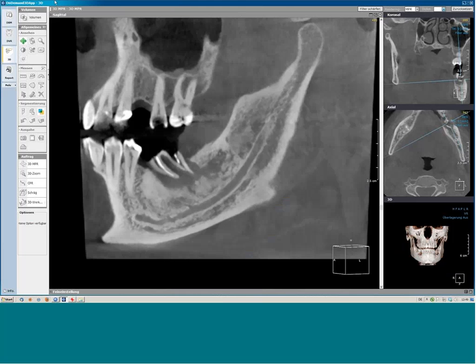And here we have a pattern which I want to show you in detail. This is a patient with some fractured roots and some really large periapical inflammation. What you can see here is a reactive bone change. For remembering that, I will show you immediately the other side of the lower jaw. So just compare this side with the normal side.